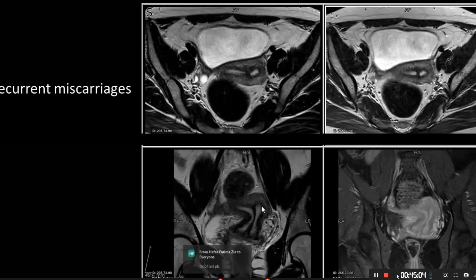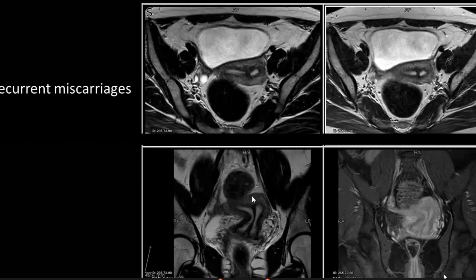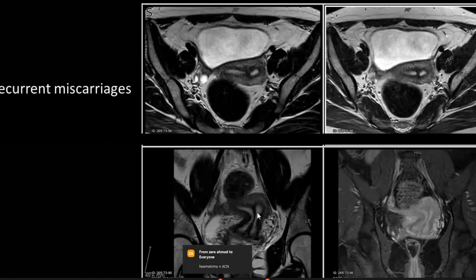We see a complete hypointense septum, as you can see here. In the didelphys uterus, you have to see some separation between the horns — this will not be continuous as we see in this case. The separating part would not be a hypointense septum; it would be more myometrium-like.